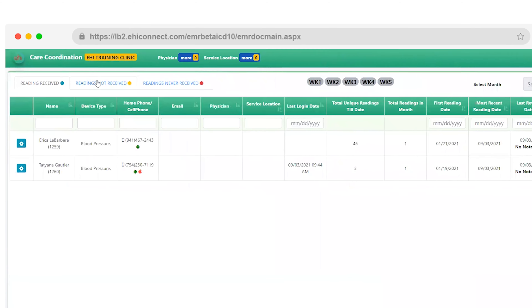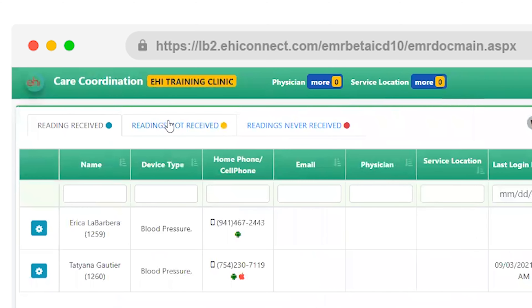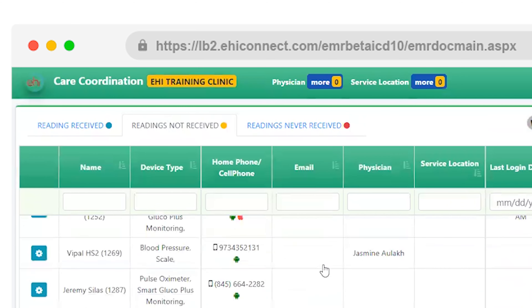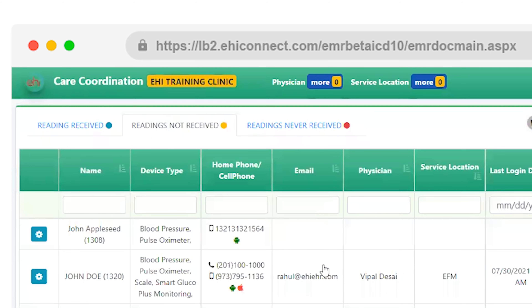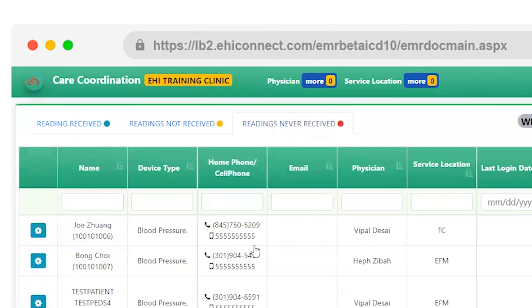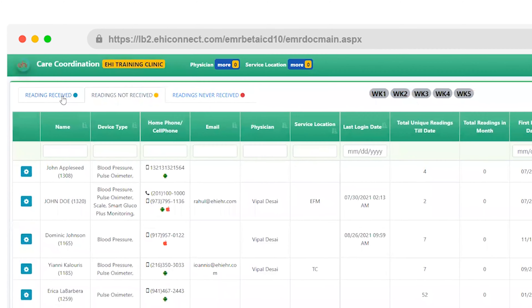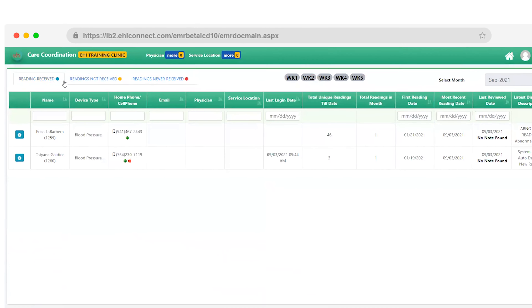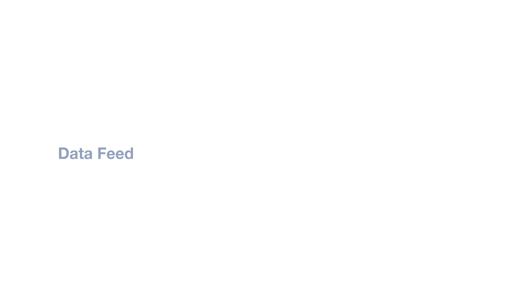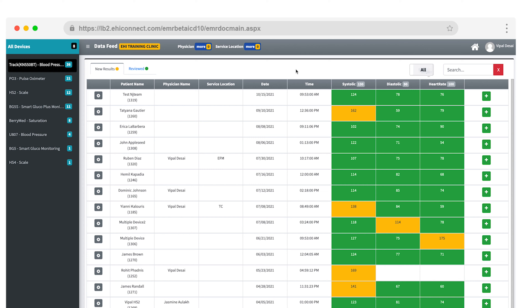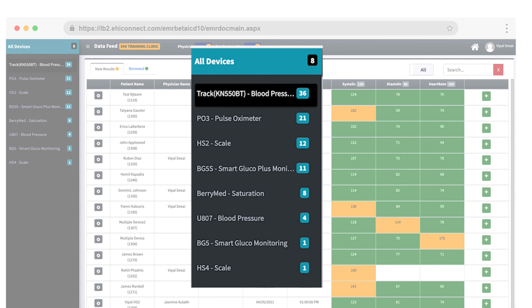Under Care Coordination, you can see how many patients are actively taking readings and how many are not. Under Data Feed, you'll see your patient's readings filtered by their medical device.